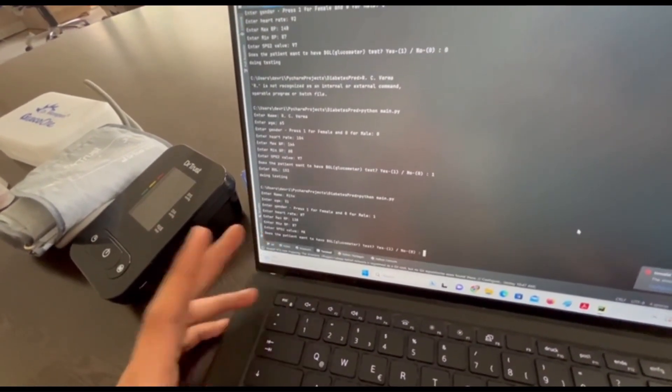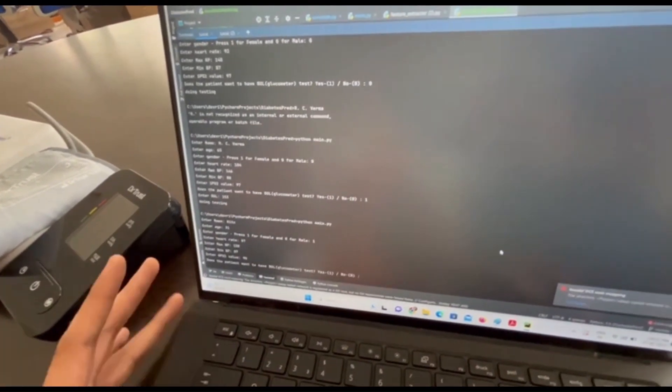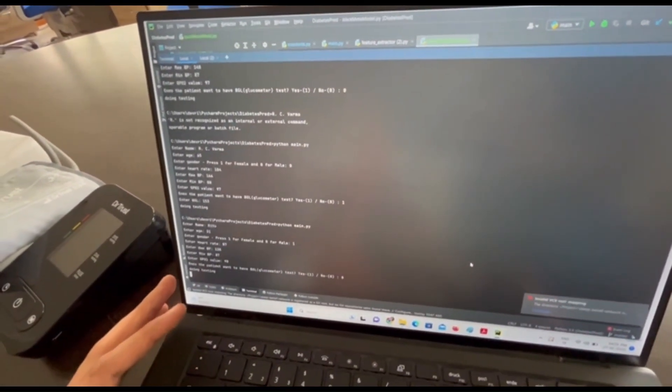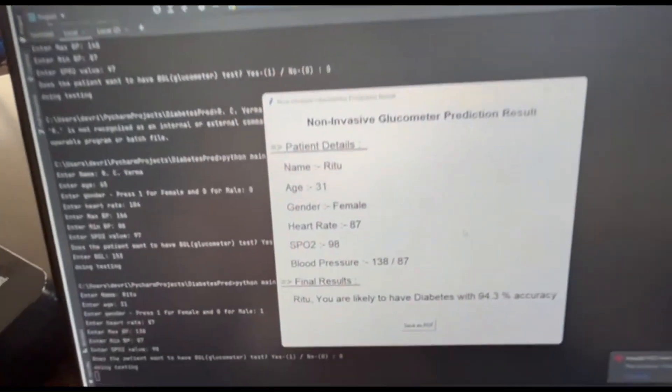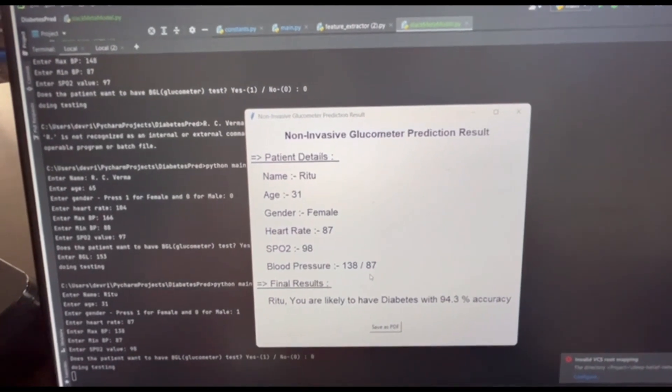It's asking if I want to have the prick test just to print it on the report. I'll say no for now though we'll validate it later. It's testing using pre-trained hyper-tuned ML models at the back end and we have the results and it says you are likely to have diabetes.